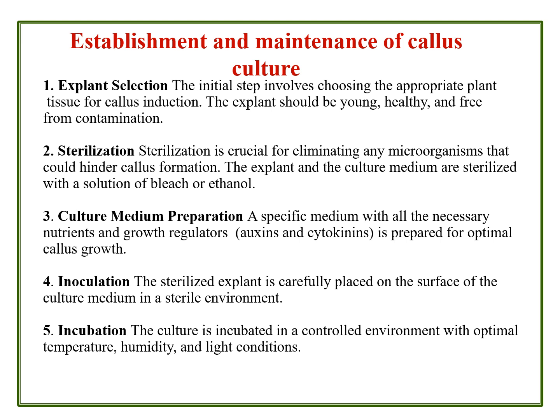All the culture plates are sterilized beforehand, either in an autoclave or a hot air oven, that is dry heat sterilization. All the glassware or metalware can be sterilized in the autoclave or in the hot air oven, and they must be opened and faced to the filter in the laminar airflow chamber.